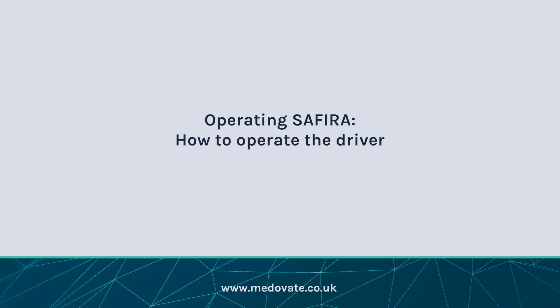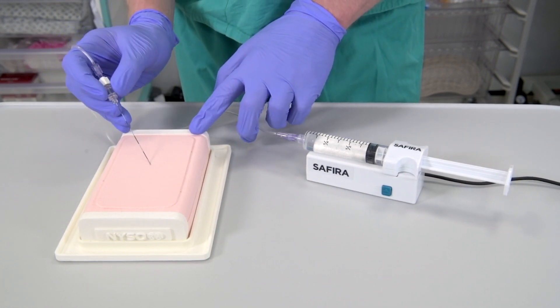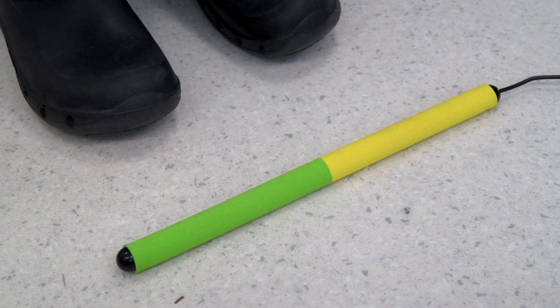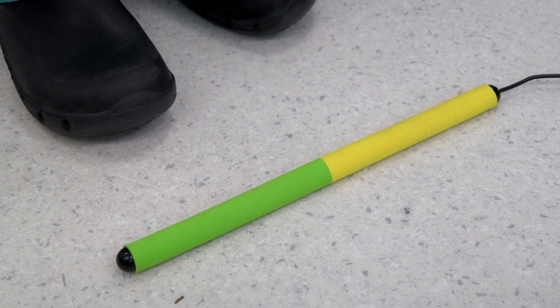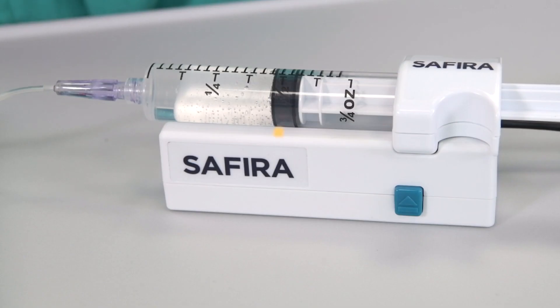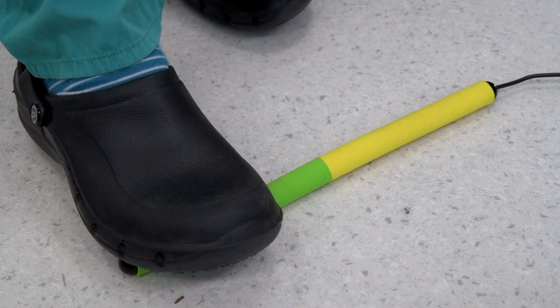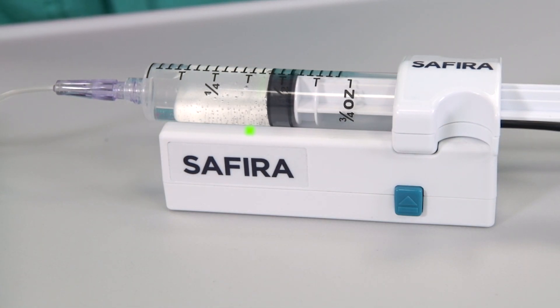How to operate the driver. Place the driver in an appropriate and safe position. When ready to begin the procedure, using standard hospital guidelines, aspirate first by pressing on the yellow end of the foot pedal nearest the cable to check for the presence of blood in the needle tubing. A yellow light will appear on the driver unit to indicate that the aspirate function is active. When ready to inject the anaesthetic, press on the green end of the foot pedal furthest from the cable. A green light will appear on the driver unit to indicate that the infusion function is active.